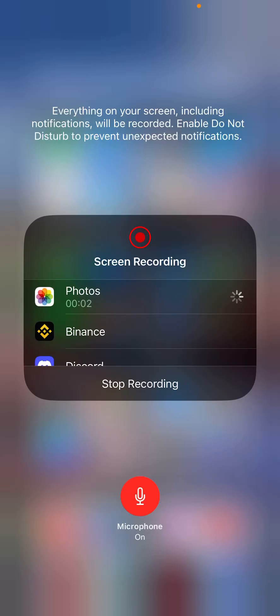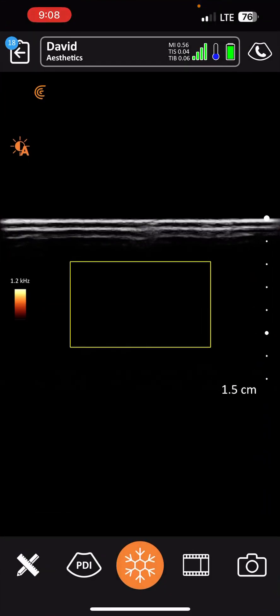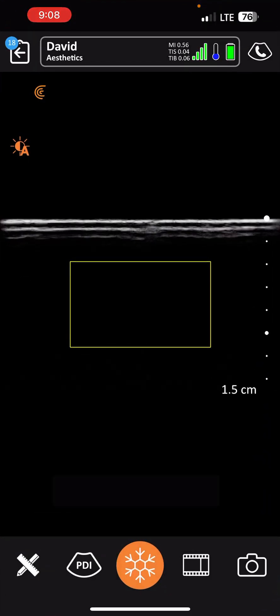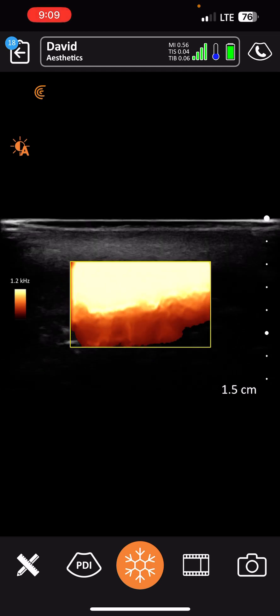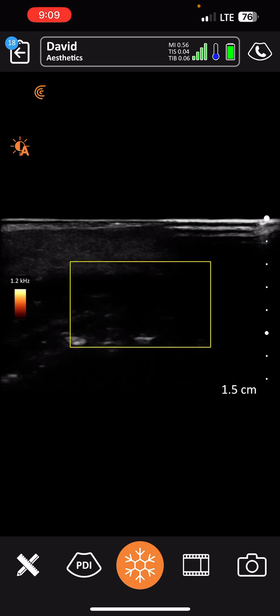She has beautiful structure in her lips, so when you do eventually get them redone it is going to be absolutely beautiful. We're going to look at ultrasound and just map the inferior labial artery and make sure that we have good blood flow.